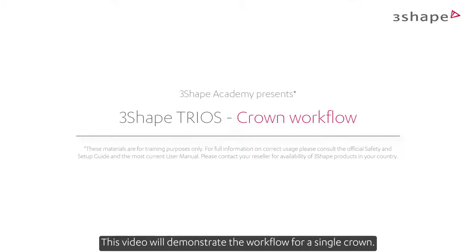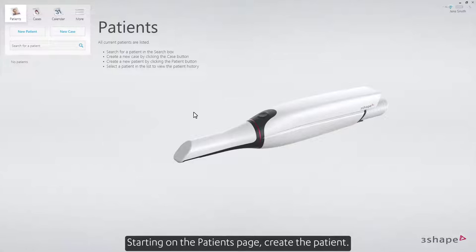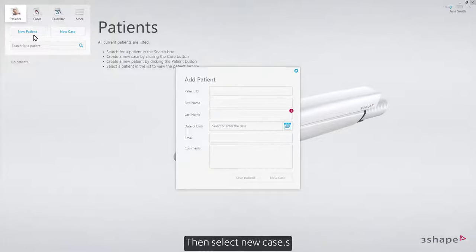This video will demonstrate the workflow for a single crown. Starting on the patient's page, create the patient, then select New Case.